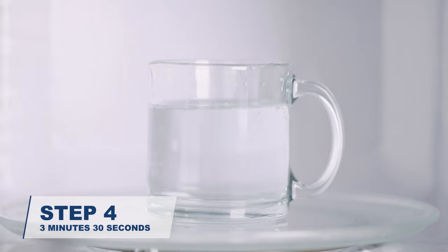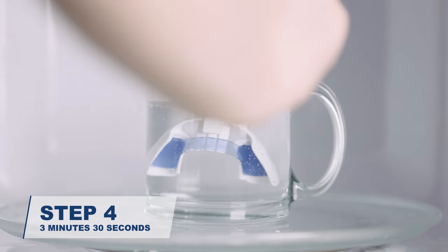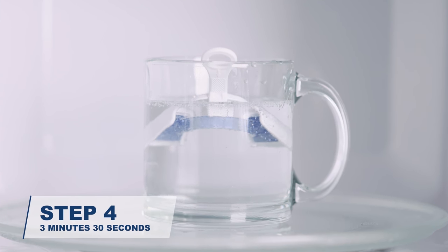Place the forming tray with the guard into the hot water with the guard tilted face down. Wait 3 minutes and 30 seconds. Using a fork if necessary, make sure the guard is submerged underwater. While waiting, get your mirror ready.